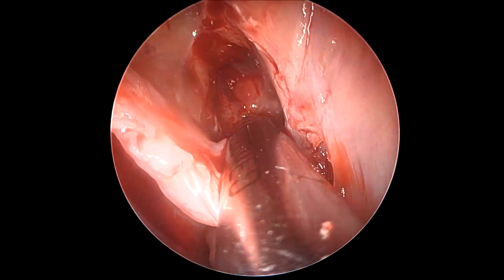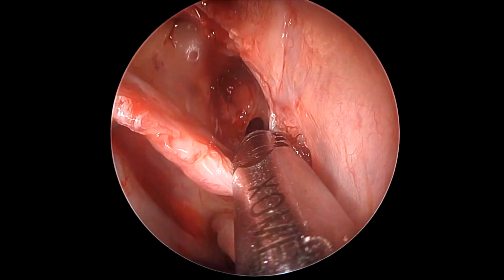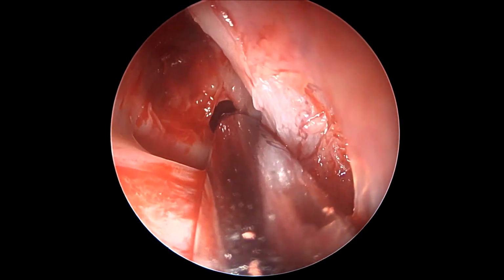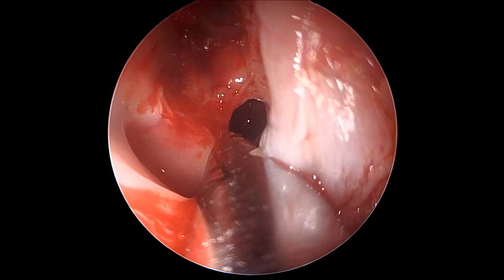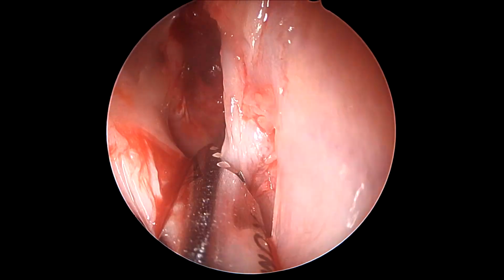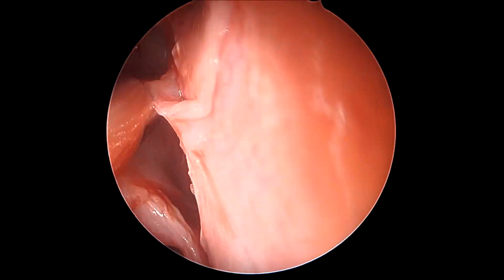So now we come to the right side of the patient. And once again, we repeat what we did on the left side by opening the sphenoid ostium widely, initially the soft tissue by the microdebrider, and later on by the bone punches to create a wide sphenoid opening.